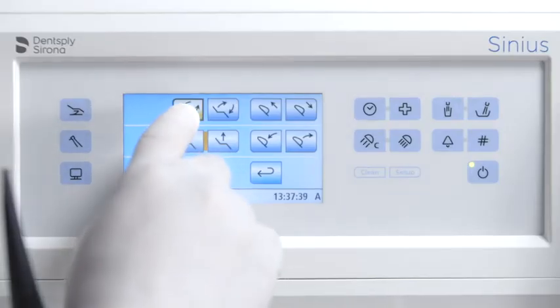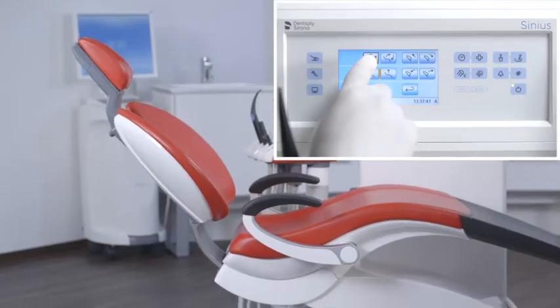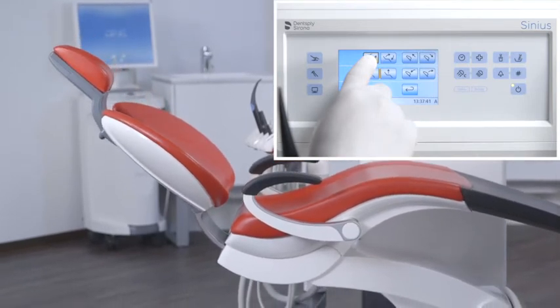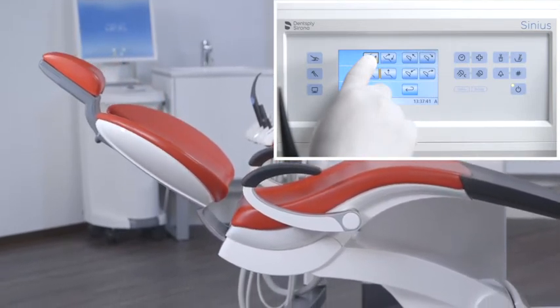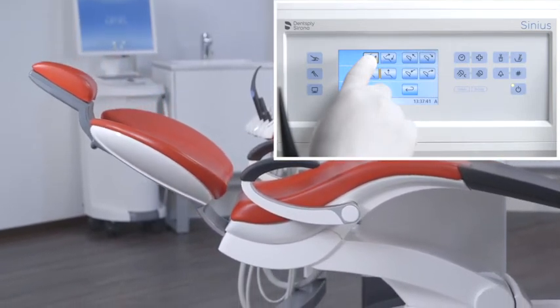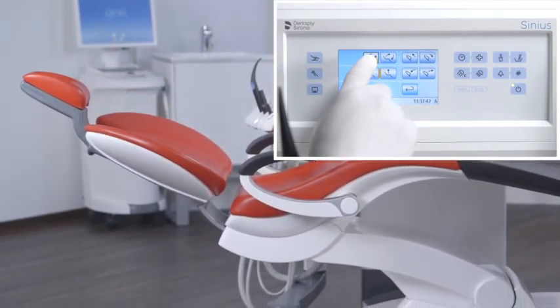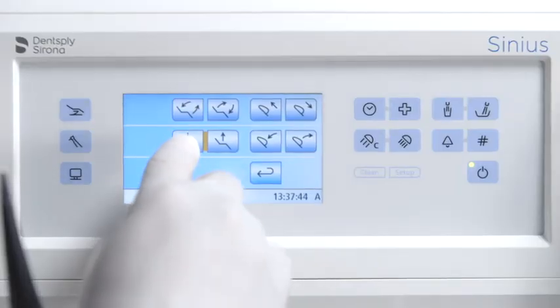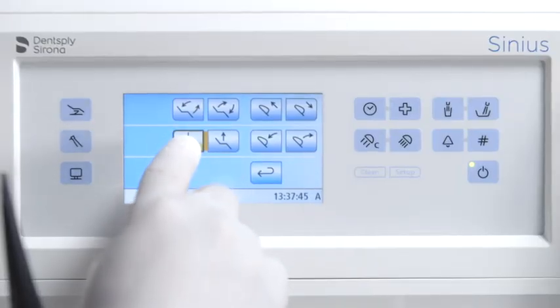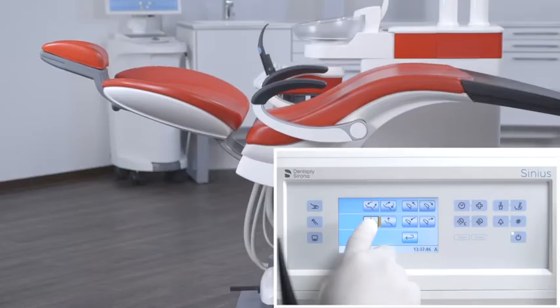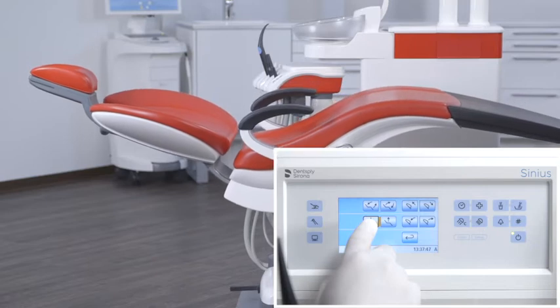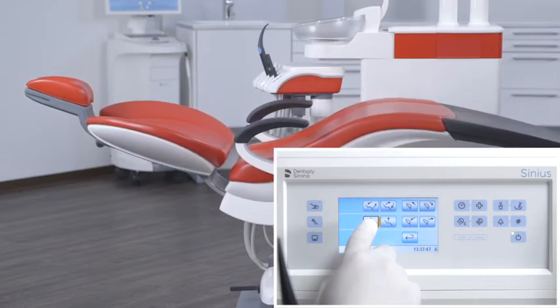Ergo motion can achieve compensated motion of the seat and backrest without any compression or stretching effects for the back. With the up and down buttons, you can move the treatment center to the optimal height.